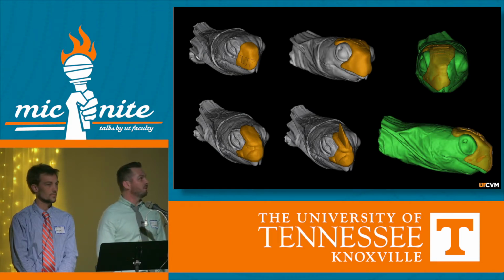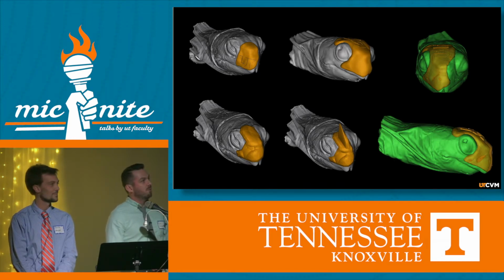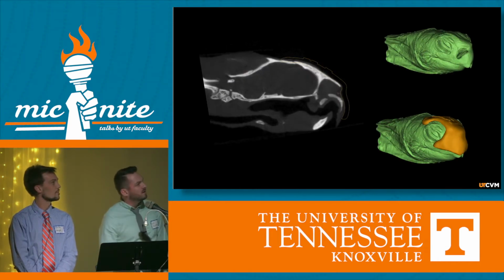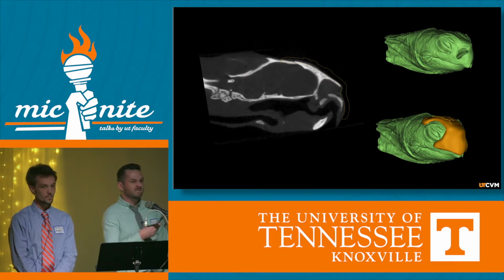So we came up with a few little face masks to use. This one right here is probably not practical, but sometimes it's just fun to do. But you can see on the right, we came up with a design we think is going to work. And once we have that design, that it looks good on our model, we need to evaluate that back on our little CT scan. It's not showing up too well. You can see the outline of the mask over top of all those slices from the CT. Once that's completed, we take the next step.